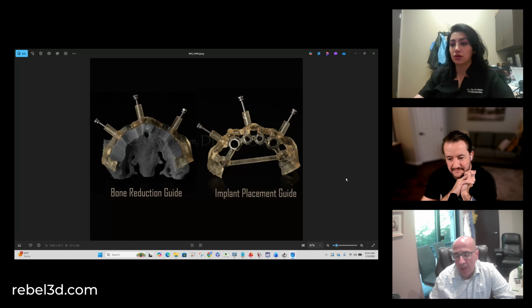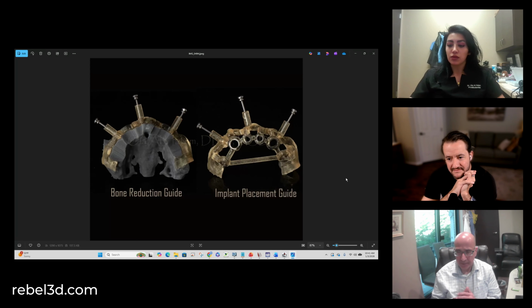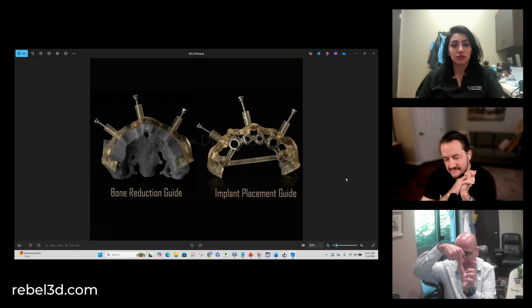Sometimes for those who know how to drill inside a socket freehand, when we go to a socket, you might need to angle your drill slightly to make a point of purchase, then go straight and start drilling. If you want to go straight ahead on a socket, the drill might slip, or you are making too much torque on this drill and it might break with you, right?